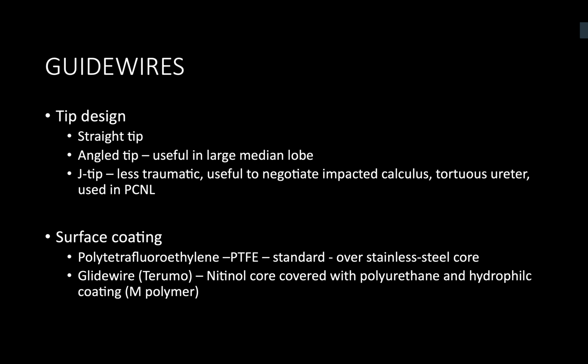Coming to the procedure itself, when you use guide wires, what are the different types of guide wires you are aware of? Guide wires can be classified in a number of ways. Broadly speaking, I classify them according to whether or not they have hydrophilic elements. Those which do not have any hydrophilic coating include the standard polytetrafluoroethylene guide wire and the Amplatz superstiff wire, and those with hydrophilic elements include the sensor guide wire with the hydrophilic tip and a Terumo zip wire which has hydrophilic coating throughout its entire length.